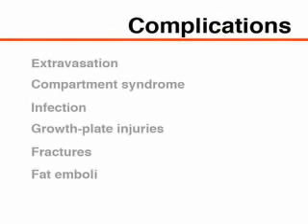Serious complications associated with intraosseous cannulation are rare. Extravasation can occur following inadvertent infusion of fluid into the soft tissue surrounding the targeted bone or beneath the periosteum. Prolonged extravasation can lead to compartment syndrome. To decrease this risk, perform serial examinations for swelling and remove intraosseous catheters once further vascular access is obtained, ideally within 24 hours. Introduction of skin flora or other pathogens can lead to infection at the insertion site, within the soft tissue, or in the bone.